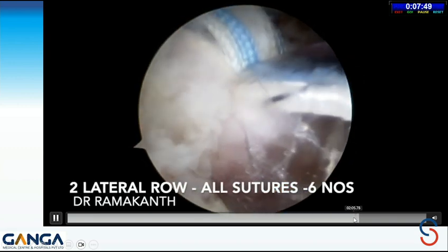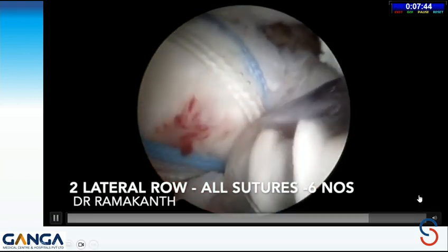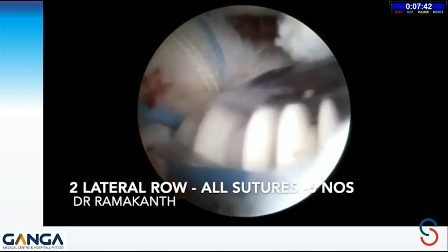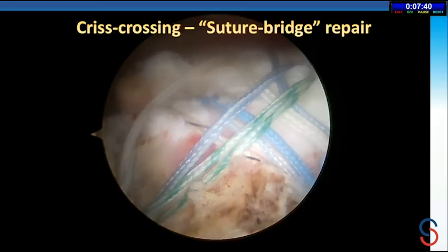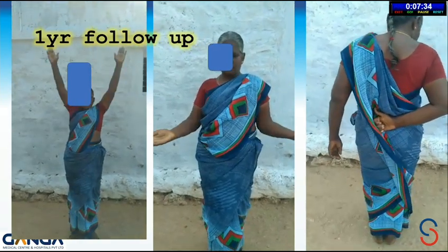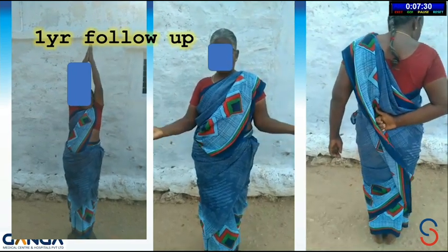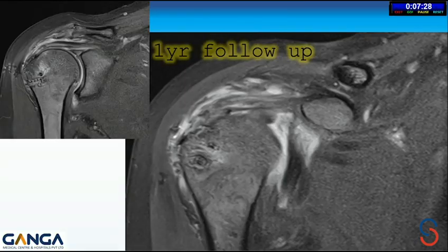Those were taken into the lateral aspect with the lateral row suture anchors. This forms the crisscross suture bridge kind of configuration for the repair. This was about 1 year follow-up, where there is complete movement of the shoulder. She's been able to do all the activities.